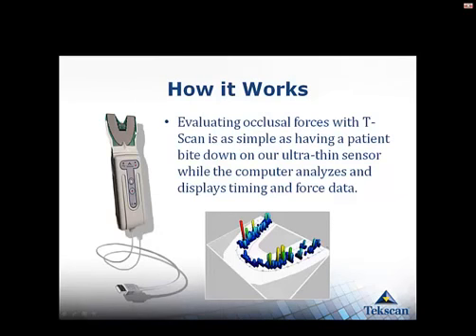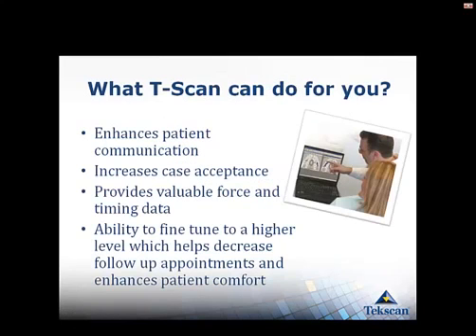So how it works is the patient bites down on the sensor here, and we're going to get a readout on the computer screen. And we're going to be able to see the force and timing data.